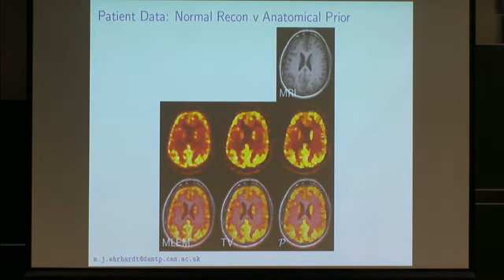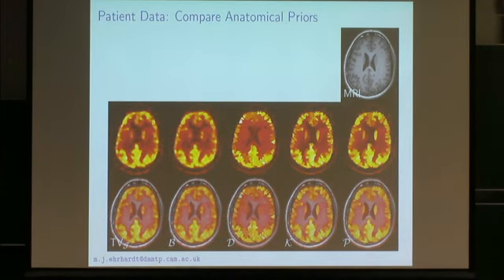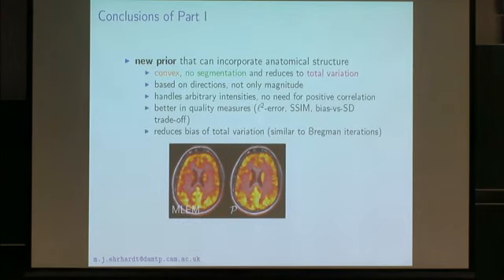Pretty much the same conclusion can also be drawn from the clinical data, where again using the high resolution MR information helps you to enhance the PET reconstruction. And this is a comparison of the five priors. Let's maybe skip this one.